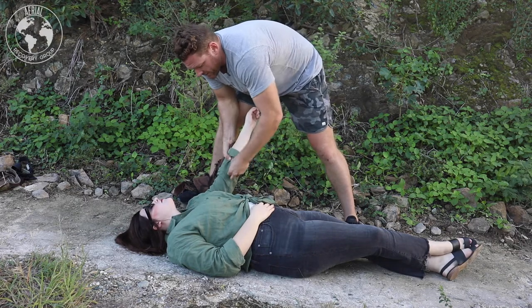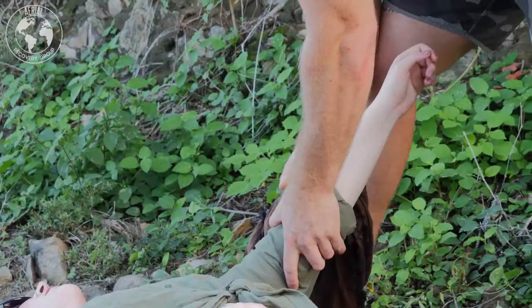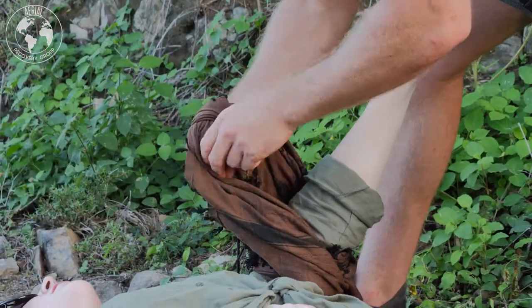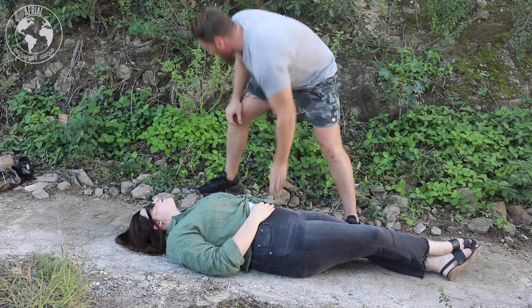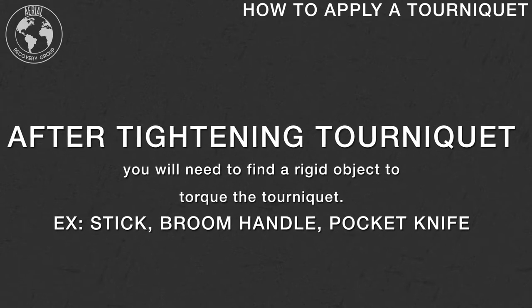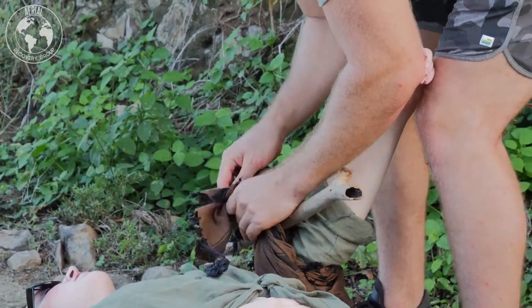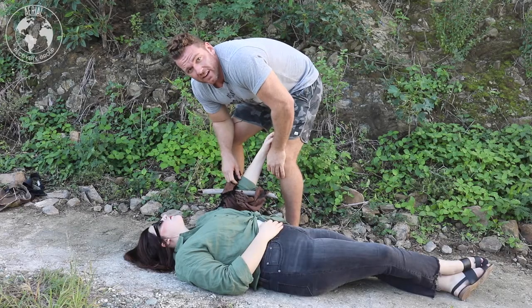I'll apply it two inches above the joint that's directly above the injury. If the injury is up on the upper arm, I'll just put it as high up into the armpit as I can. So I find her joint here, two inches up, go around once, around here, and tie a knot — cinch it down real tight. Then I'll look around and find something I can torque this tourniquet with. In this case I found a stick. I'll place the stick directly on top of the knot, then take the two loose ends and tie another knot on top of it — essentially a double knot with a stick in between the two knots.